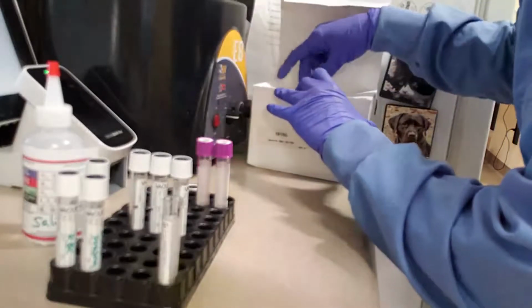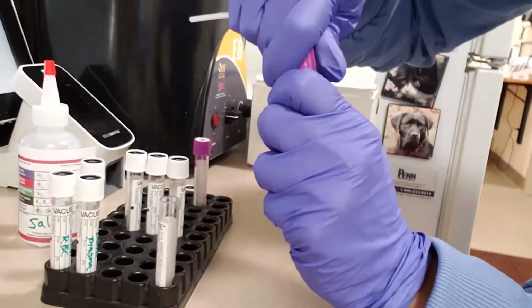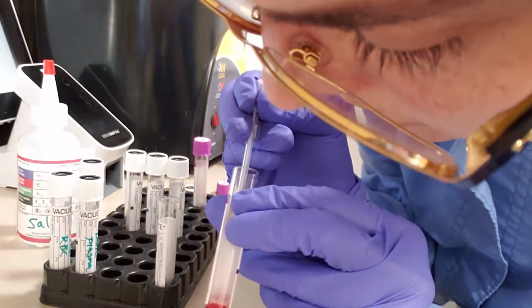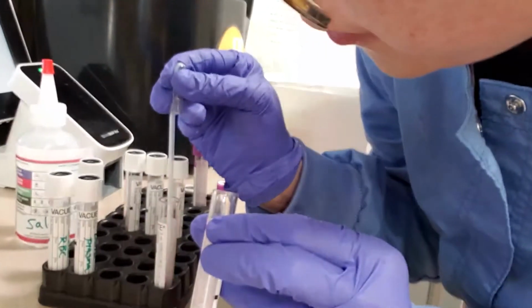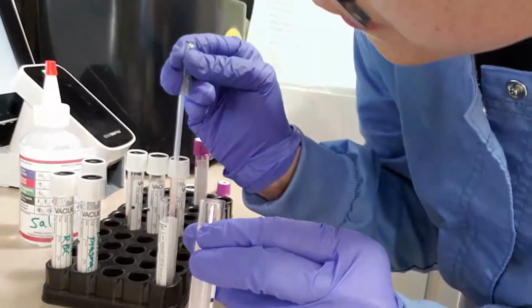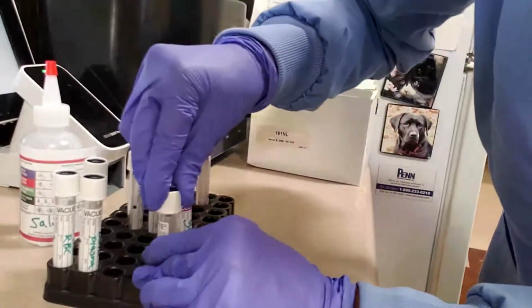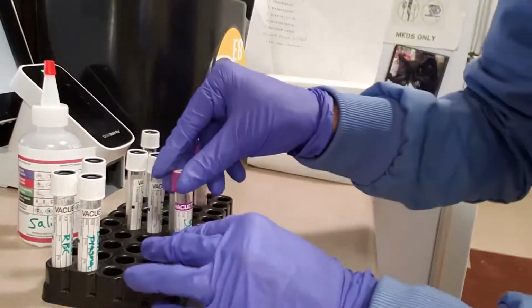Get our fresh pipette, and then take our recipient sample, and very carefully, without mixing or disturbing our cells, we want to go in and get our plasma and then put it into our tube. I want to discard that, and then we'll hold on to this for just a second.